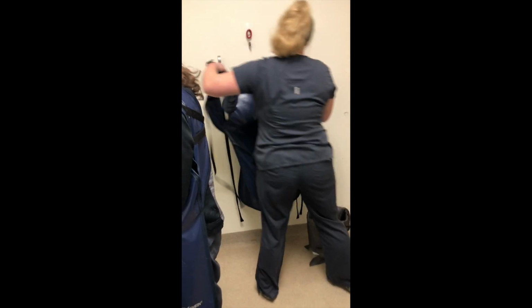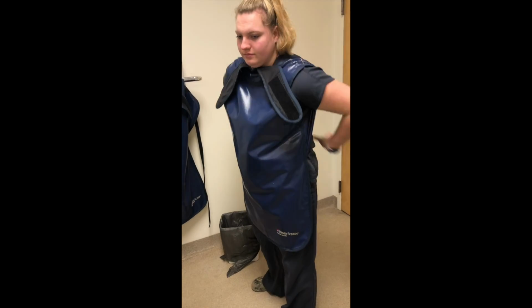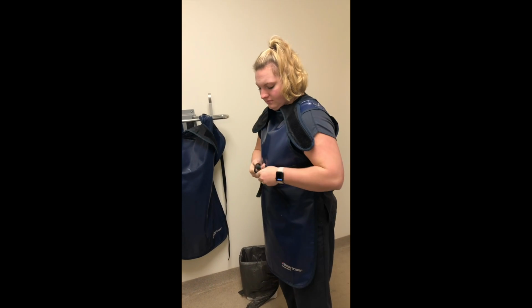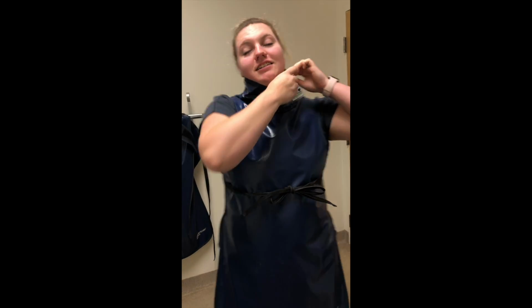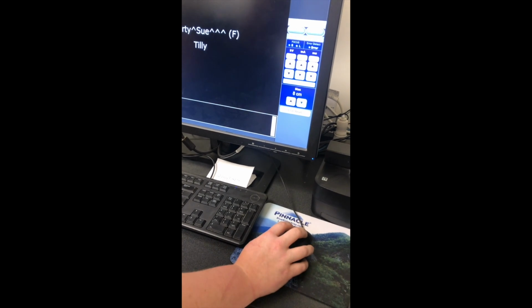Once you have set your radiograph unit to the specific shots needed, don all of the required PPE. Survey radiographs should be performed before the contrast study.